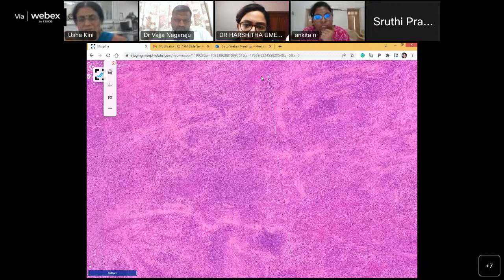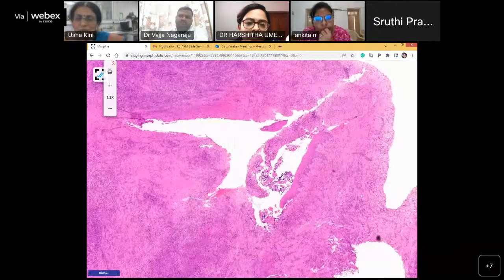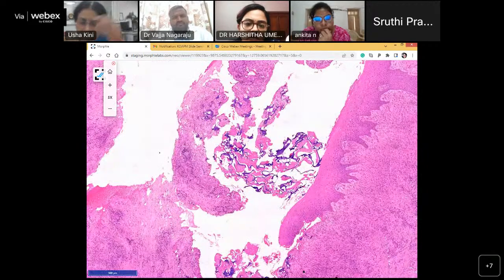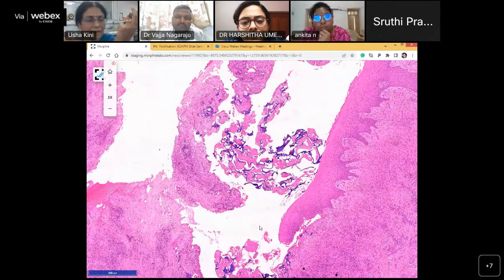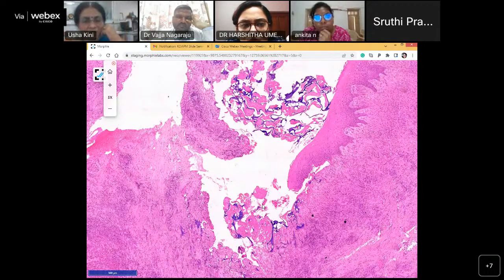What is this material which you said was something to do with cartilage? No. They have injected into the blood vessel something that makes the blood vessels collapse, and this is iatrogenic induced, so that the tissue bleeds less. Okay, so this is not to be read as something like cartilage. You see more of this because the ENT surgeons use that very often, and you must get used to seeing those tissue artifacts.